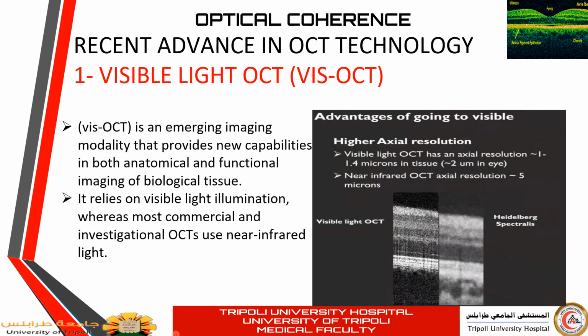I will speak a few words about the recent advance in the technology of OCT, what's known as visible light OCT. This is a new emerging modality that provides a new capability in both anatomical and functional imaging of the biological structure. Using this visible light source, it gives you a very high resolution with very high details. This is a new emerging technology, and it has very good potential for future OCTs.